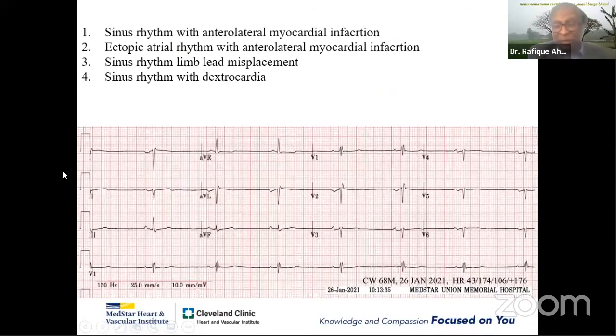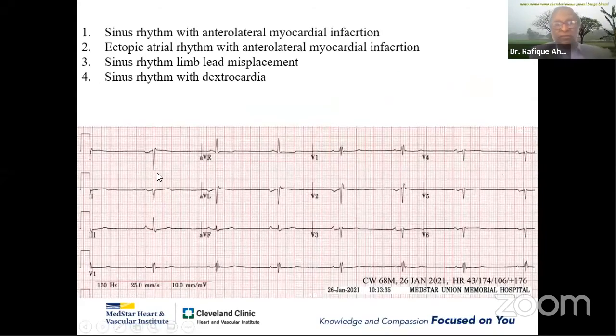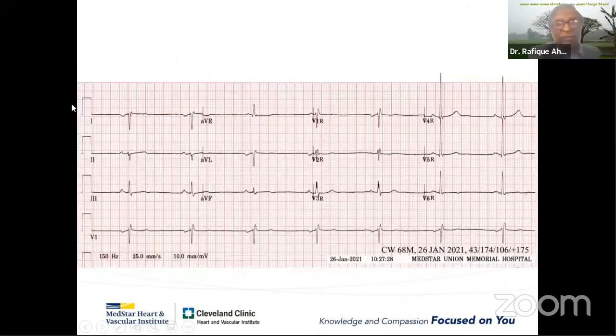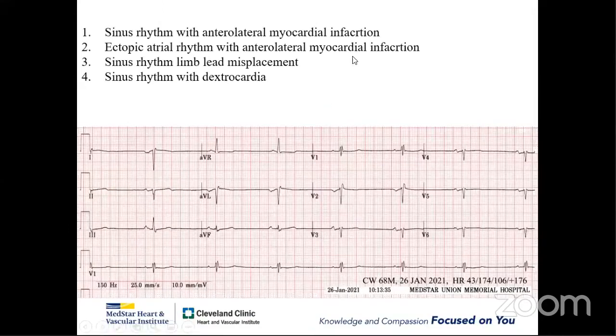So Shahana showed, this is the patient that I did cardioversion recently, and this is the post-cardioversion ECG. I just added it. I thought it would be curious. Oh, sorry. So what do you think? We have the poll, right? Sir, I'm starting the poll now then. Review the poll.